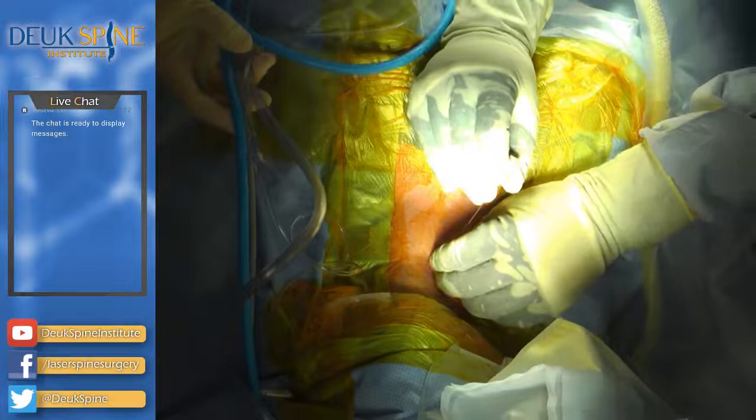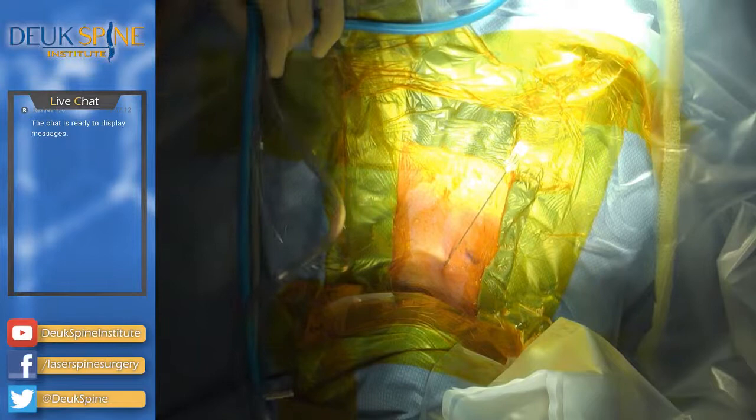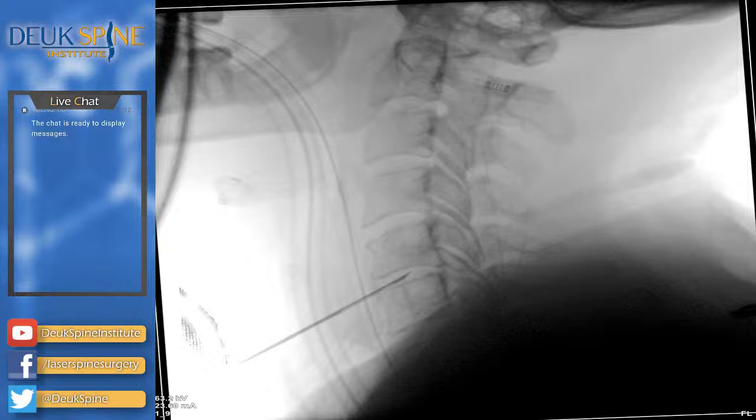I want to make sure, using the x-ray machine, that we're at the proper disc that needs to be fixed. If we count from the top of the cervical spine, you can see there's a tall bone up there near the jaw. That's number 2. The one below that is 3, 4, 5, 6. I have counted C5-6. Luis, you agree? We're treating C5-6. So we're at the proper disc.